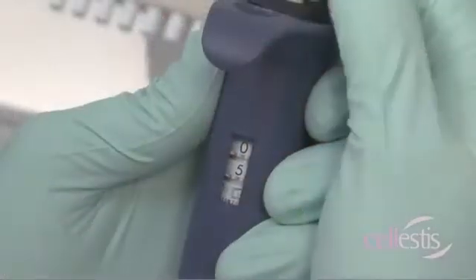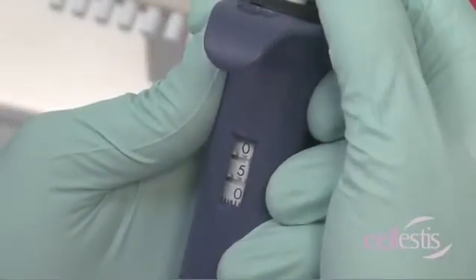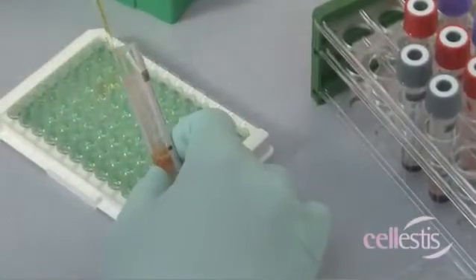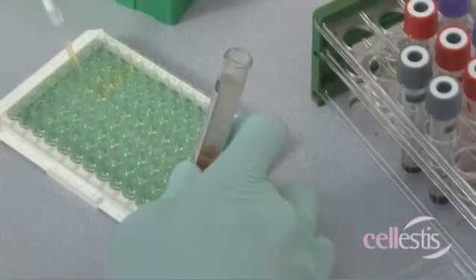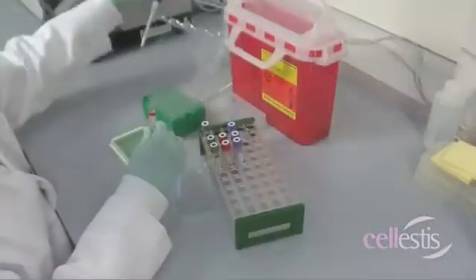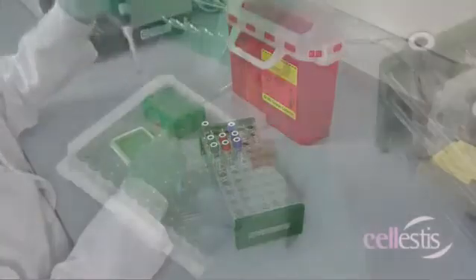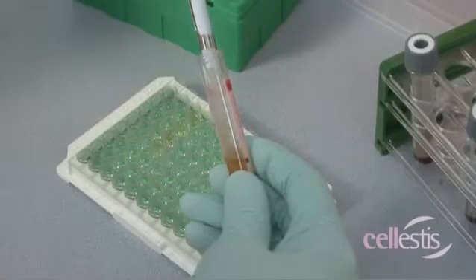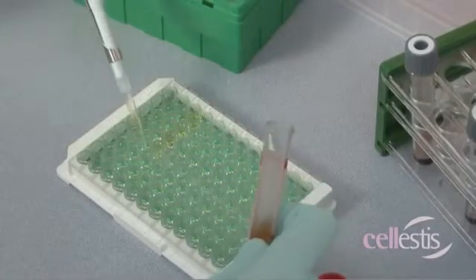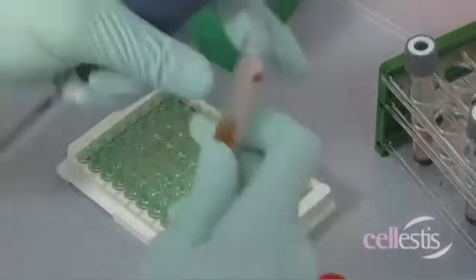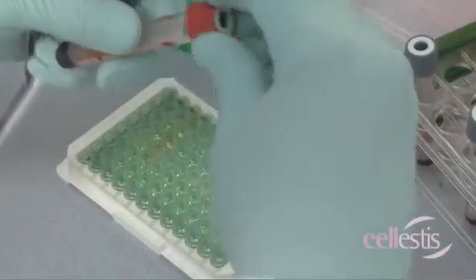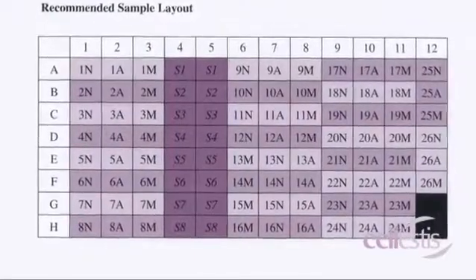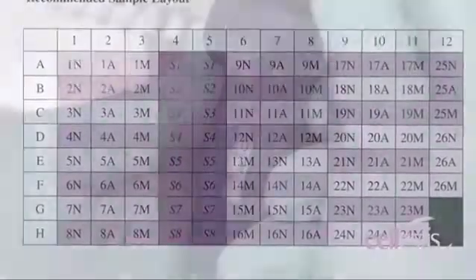Add 50 microliters of each plasma sample to the appropriate ELISA plate wells. You can refer to your region-specific package insert for a recommended sample layout.